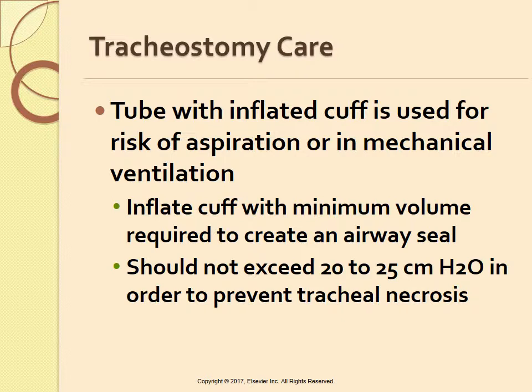Cuff inflation pressure can be measured with a handheld cuff manometer. The pressure should be monitored at least every 8 hours. Cuff inflation pressure should not exceed 20 to 25 centimeters, because higher pressures may compress tracheal capillaries, limit blood flow, and predispose to tracheal necrosis.